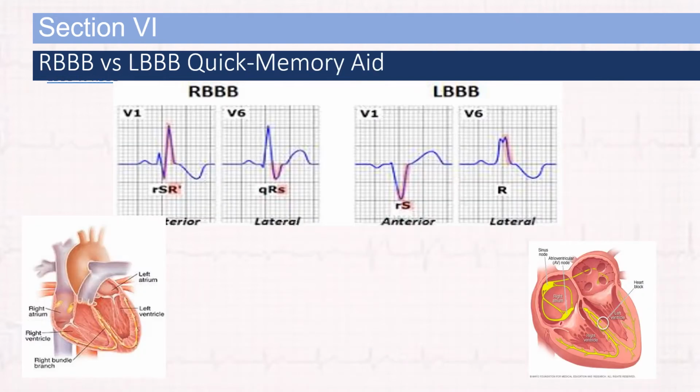We're going to take a stop at this quick memory aid for right bundle branch block and left bundle branch block.